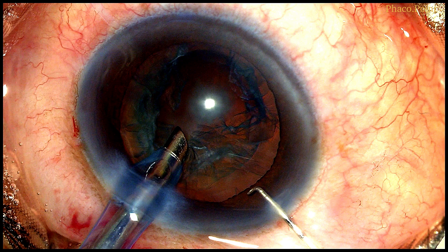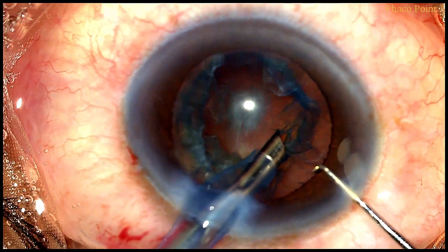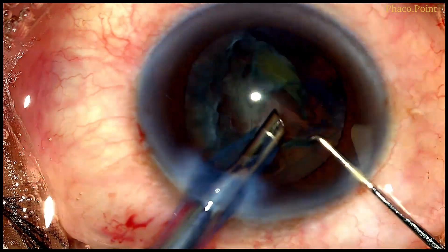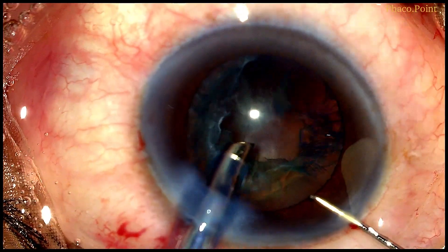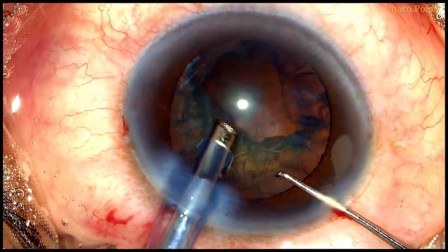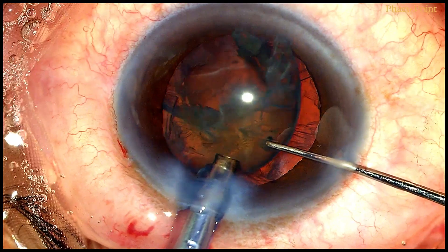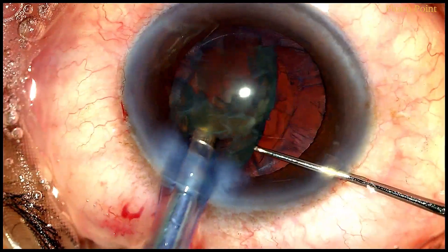Next we move to epinucleus removal. In this case, I plan to go in and aspirate the epinucleus directly from within the capsular bag. Having an oval rhexis gives me more room for the epinucleus to prolapse out with greater ease into the anterior chamber, thereby facilitating its easy removal. Watch the ease with which the epinucleus is prolapsed out — the oval rhexis makes this manoeuvre a lot easier.